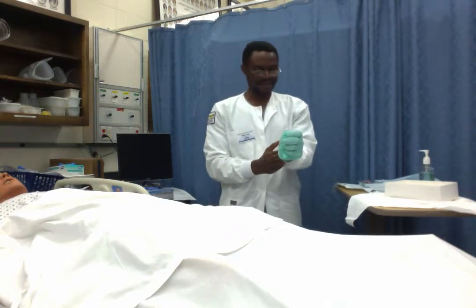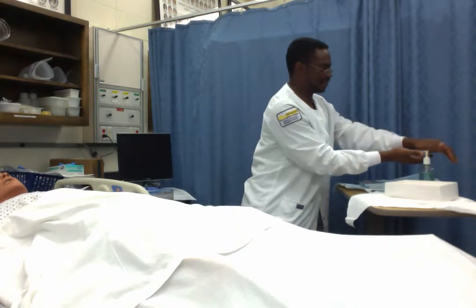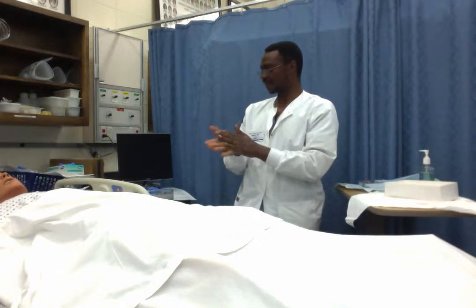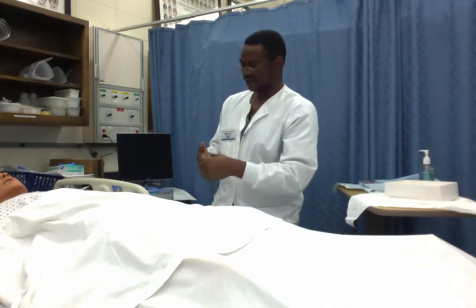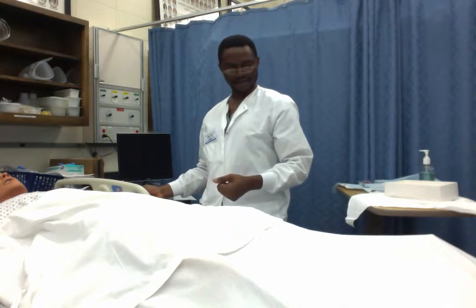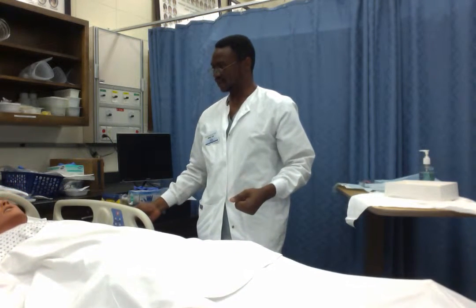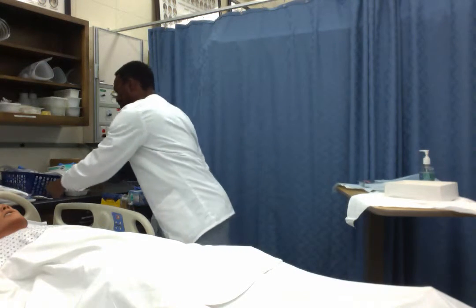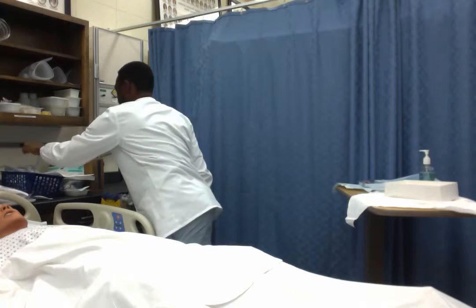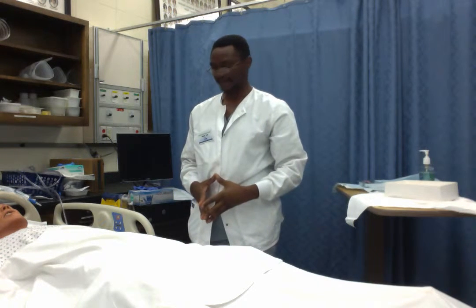I can now take off my gloves and dispose of them. I will assess the client for pain after the procedure, and then I will make sure I put the bed to the lowest position and place the call light beside the patient. I'll tell him to use the call light to reach me if there is anything he wants from me.